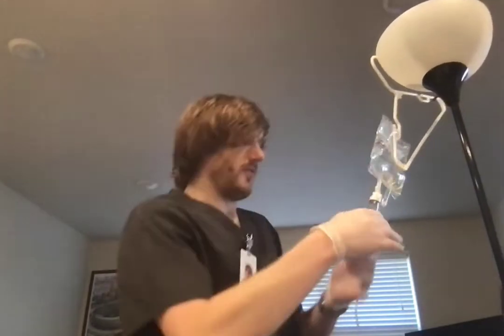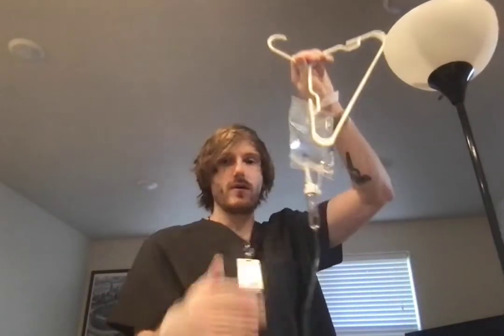These are a little bit different IV bags than I've ever used. I've never actually had to do that before. Normally you just poke it in. This is going to fill up a little bit. If you want to get this chamber to fill up a little bit more, you would squeeze and squish it a little to purge it. I don't know if you can actually see that. I'll bring it a little bit closer to you.